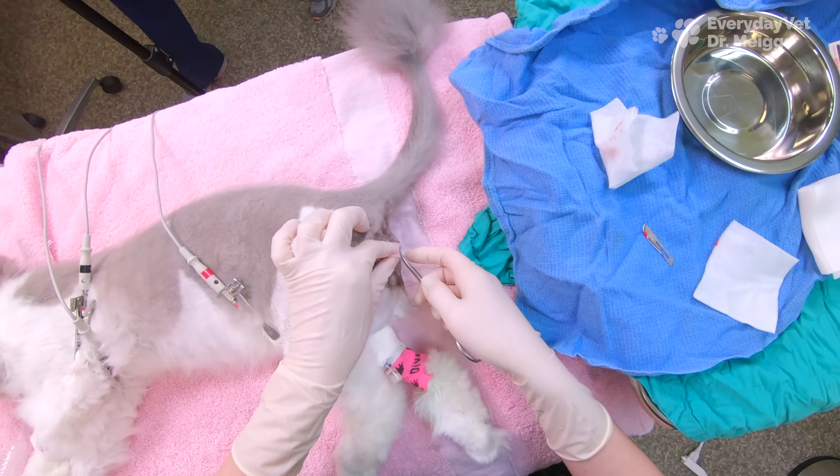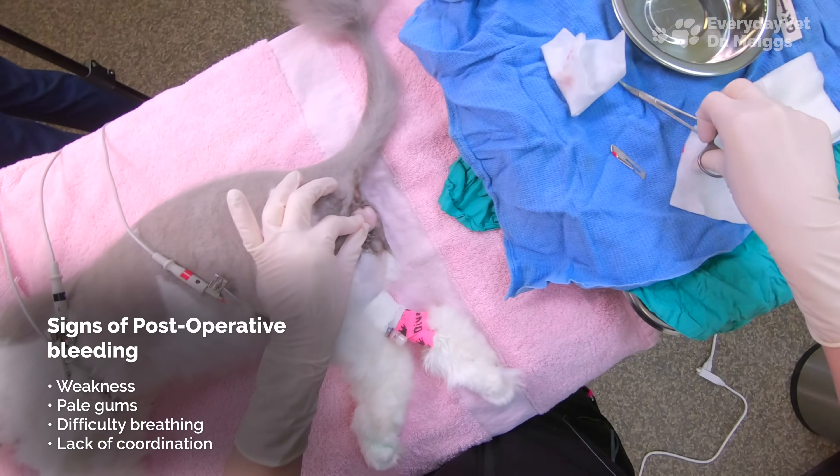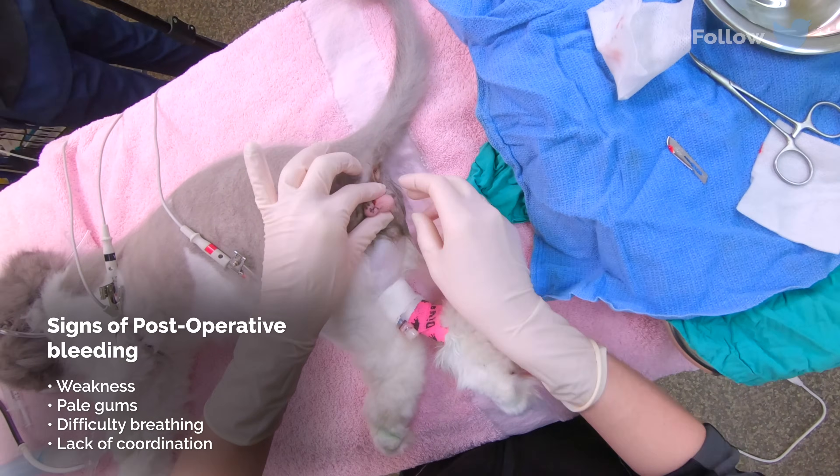I always make sure to check my knot for bleeding before I let go of it. If I were to let go and then it starts bleeding, I'd have to go find those vessels. But if I notice the bleeding now while it's still in my hands, I can easily address it before it becomes a problem.